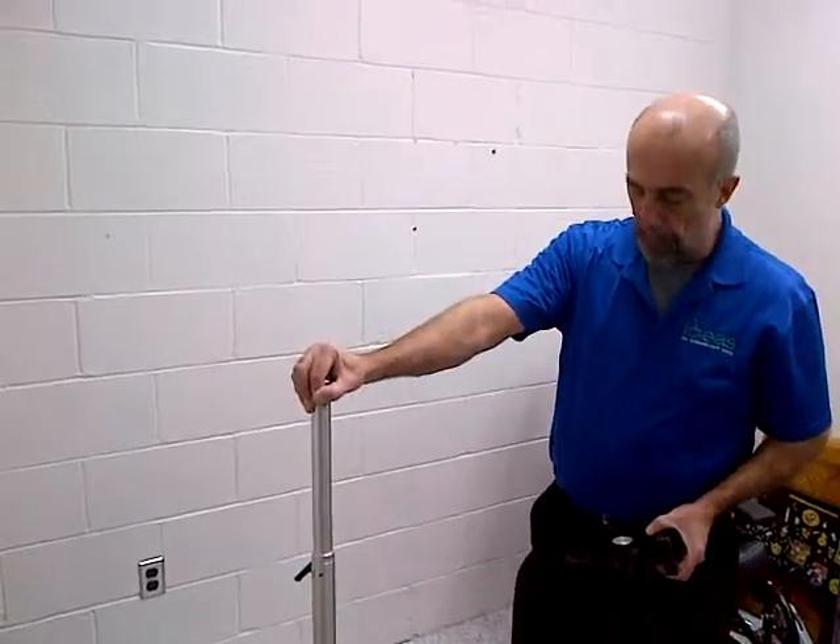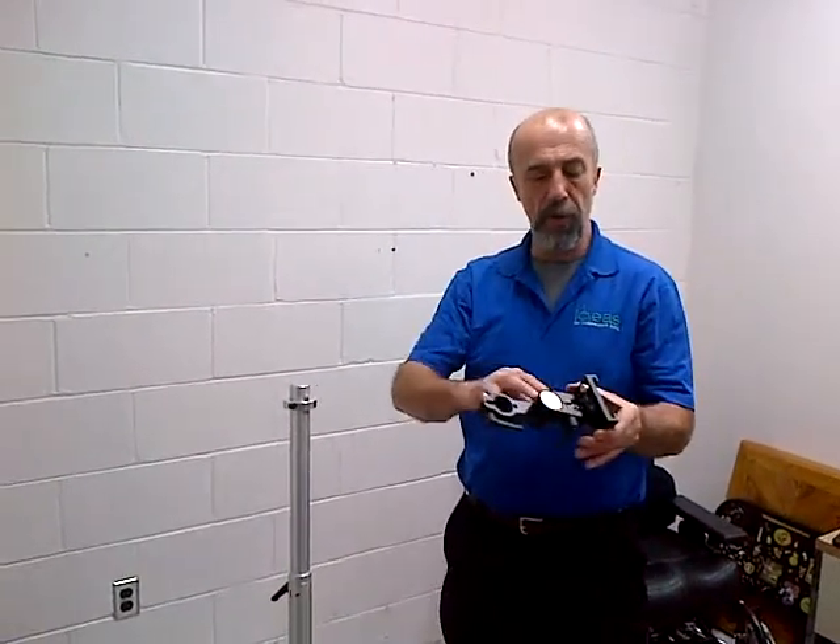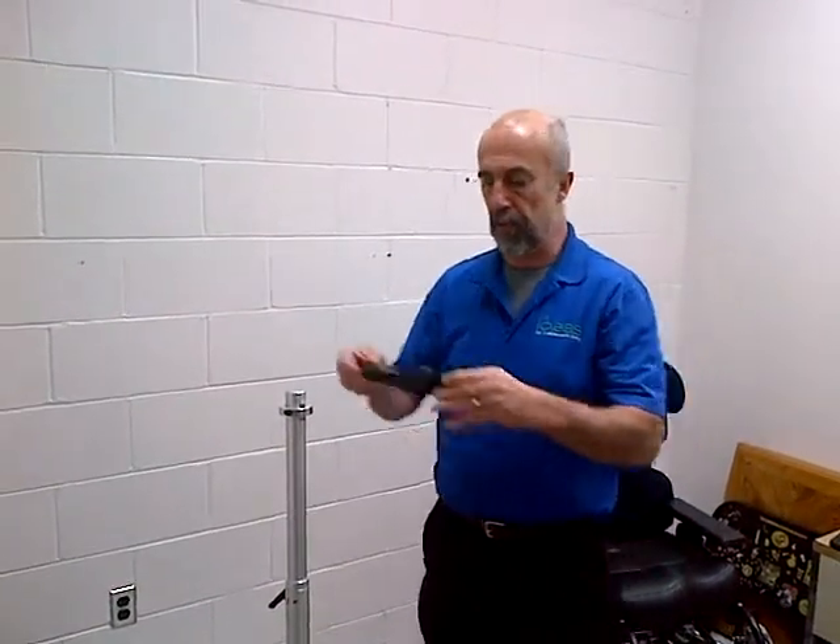When using the rolling floor mount for an IMAX or an IGAZE system, what we're going to do is use the HT head. There's no arms involved here, it's just the front and back.